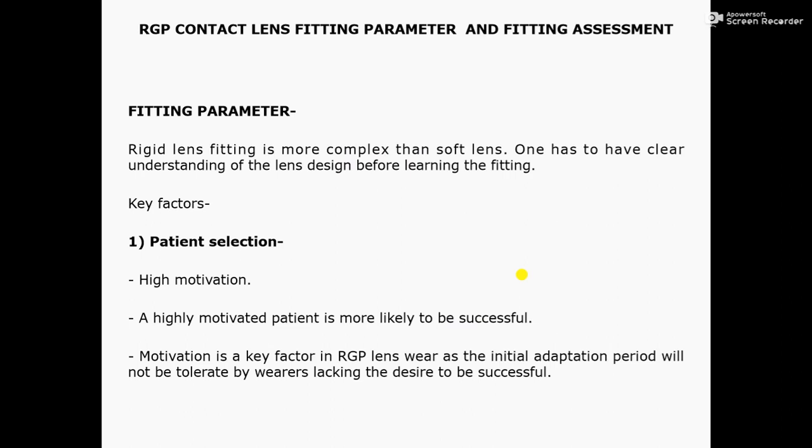RGP contact lens fitting is more complex than soft contact lens. One has to have a clear understanding of the lens design before learning the fitting. Here, for RGP contact lens, we need to understand more about fitting parameters, and the patient also needs to understand the do's and don'ts of contact lens.